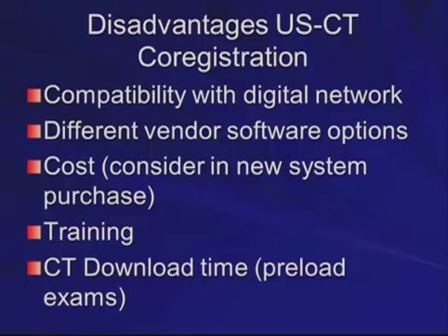All right, what are the disadvantages of ultrasound co-registration? Well, first of all, it's important that when it's set up, it's compatible with whatever digital network or PACS you're using. And so therefore, before you have your vendor leave your department, make sure that it works. Make sure that the CTs and MRs readily download into the machine.